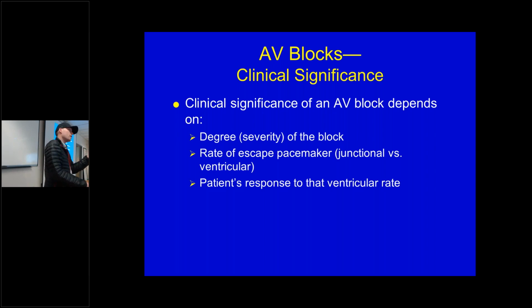If that heart rate is more at the 20, then what's happening? Right, they go into cardiac arrest really quickly, because they're not perfusing anything. So somebody that suddenly goes into that and their automaticity is low, that can be significantly life-threatening. So you guys could come on a patient that's out, that has a heart rate in the 20s, and if you get a strip on that and recognize that it's a third-degree AV block, all I have to do is pace them. Boom, they wake up. All right, that's why it's significant to be able to recognize those things.